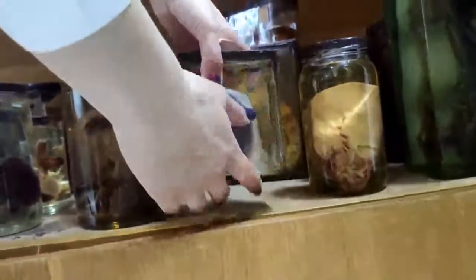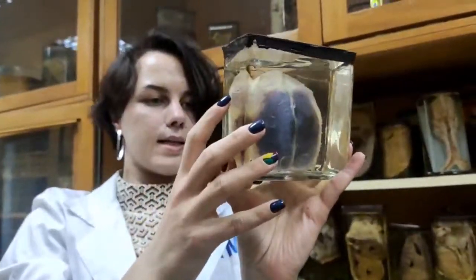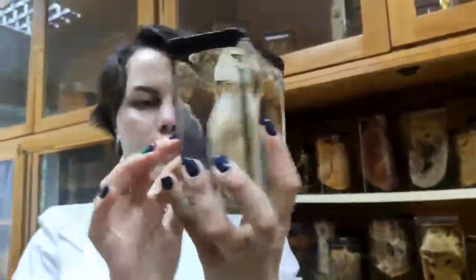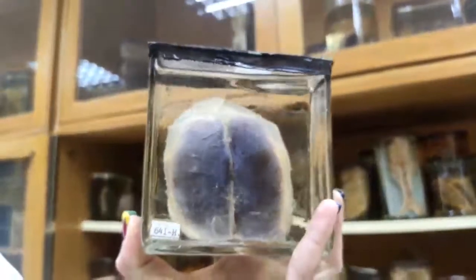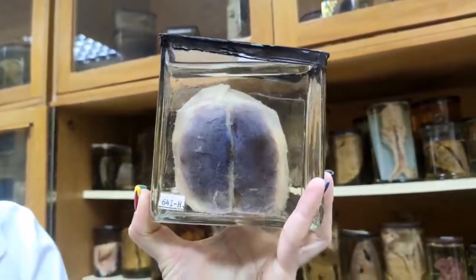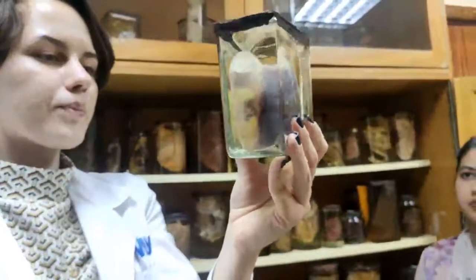The next one is cephalohematoma. So here you can see bone, and you can see bleeding. Hemorrhage. I don't remember the word in English, unfortunately. One moment, I will check.